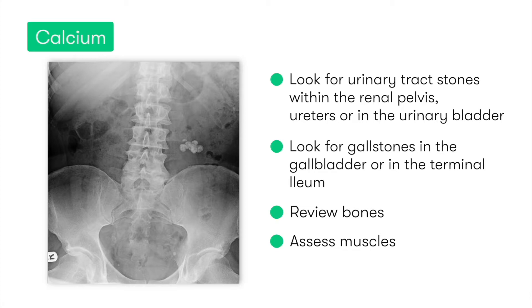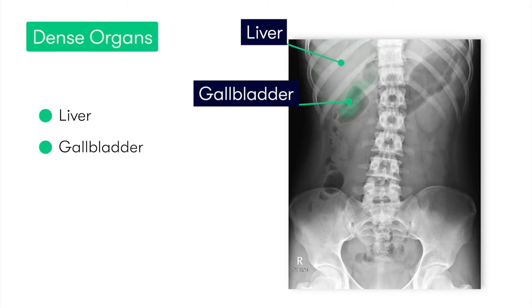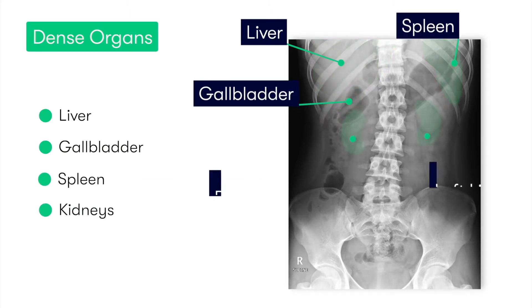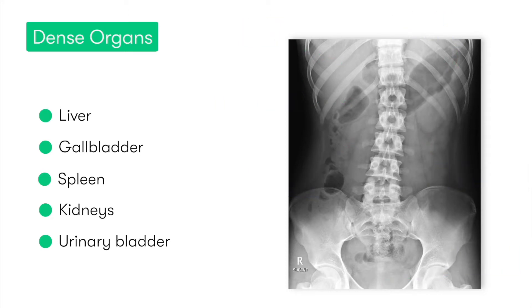As well as stones, we should also assess the bony structures and the muscles visible on abdominal X-rays to ensure we don't miss any obvious injuries or significant pathology. Moving on to D for dense structures, we want to assess the more solid intra-abdominal organs including the liver, gallbladder, spleen, kidneys, and urinary bladder. Typically we wouldn't expect to see these in great detail, but in rare instances we may identify issues such as hepatomegaly, splenomegaly, or a grossly distended urinary bladder in urinary tract obstruction.